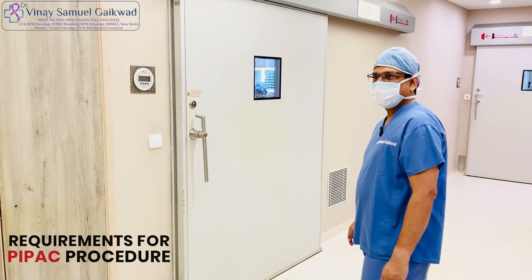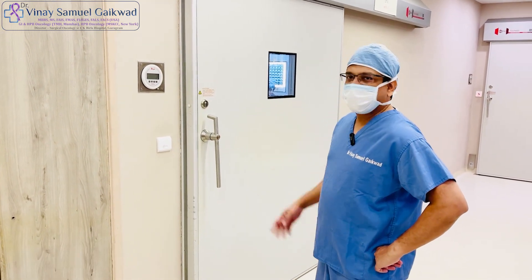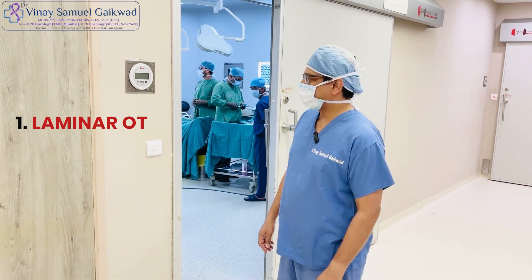I am going to show you what all requirements are there for the PIPAC procedure. The first thing you need is a laminar OT with an air flow that is positive pressure to get all the air out of the operation theatre.